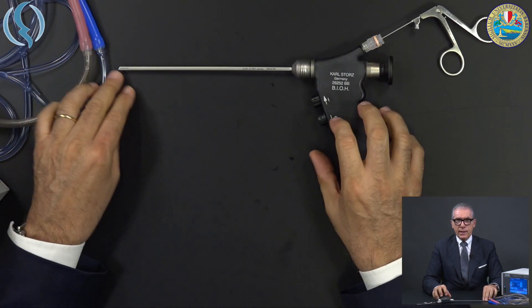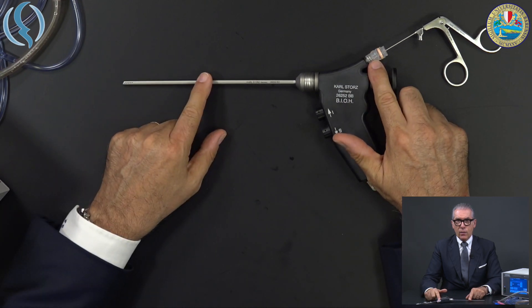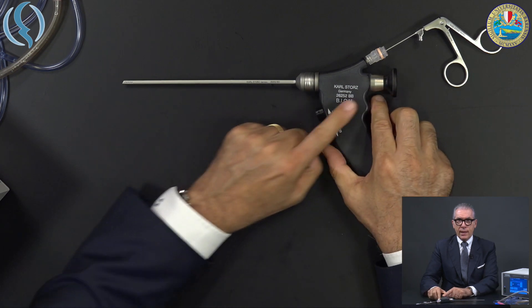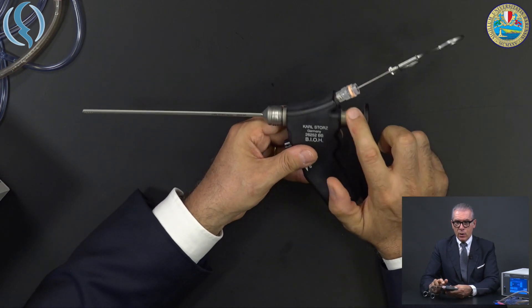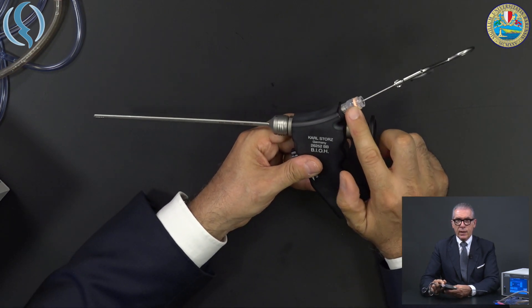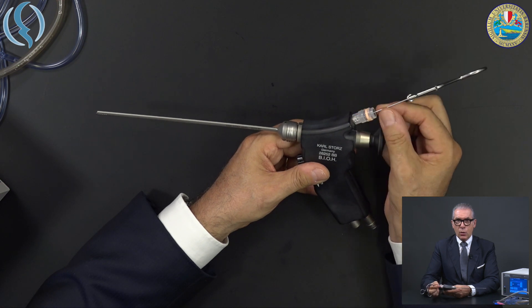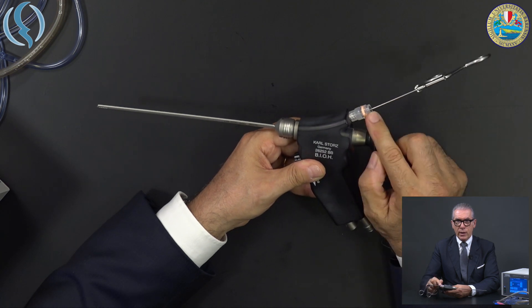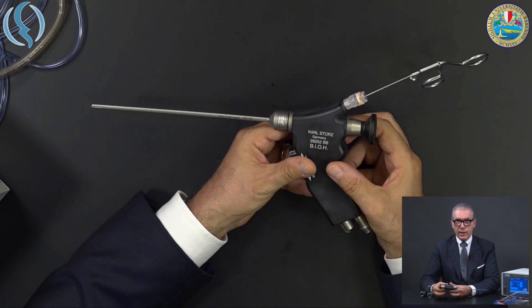Another characteristic is that the operative channel here does not present any stopcock. This is because we have an automatic valve with a membrane inside. So you can retract the instrument or insert the instrument without losing liquid thanks to these new rubber seals here.